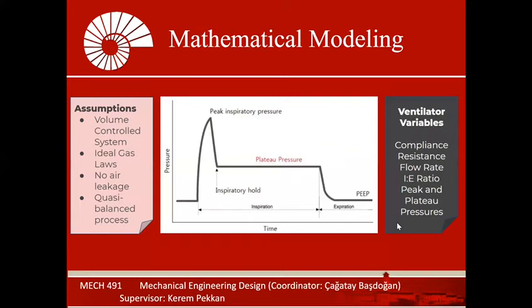For the mathematical modeling, the main issue was deciding on the type of model, since we aim to design the most convenient way for doctors. So we chose the volume controlled ventilation model, which delivers a constant flow rate during inspiration until the set volume is entirely delivered, and which lets the user change the settings more comfortably.